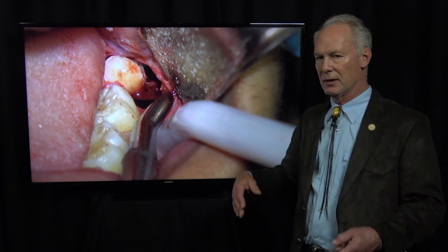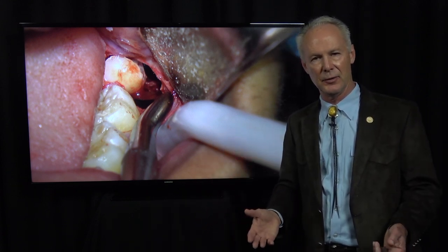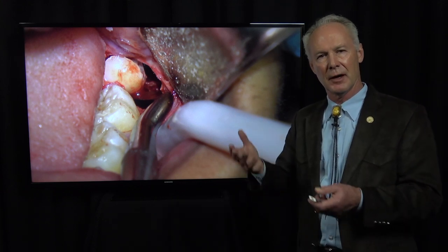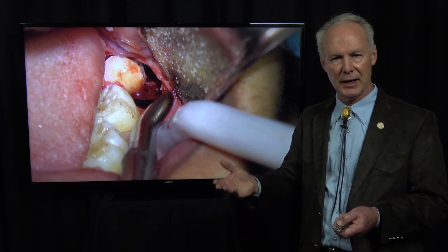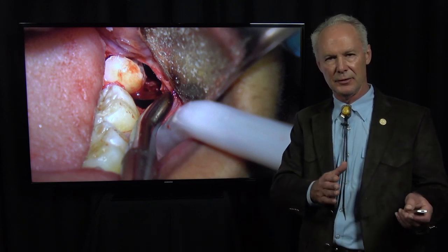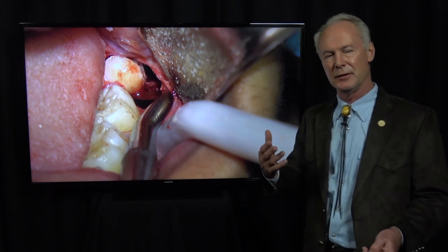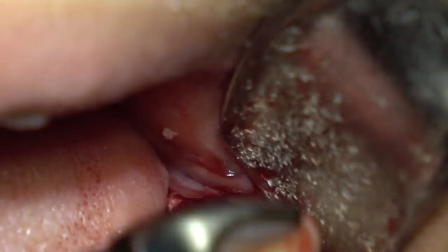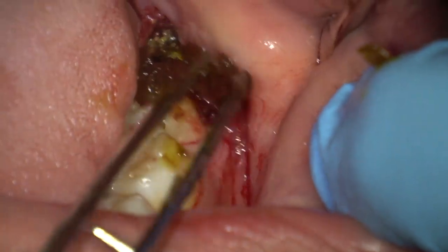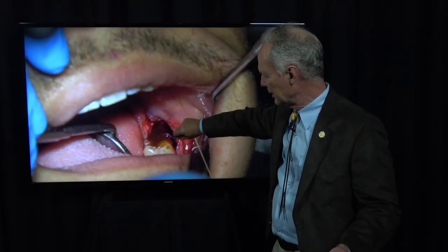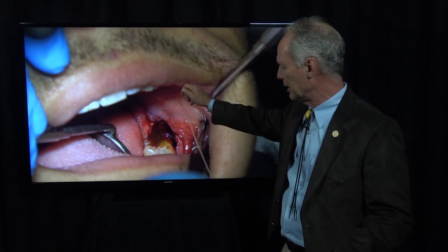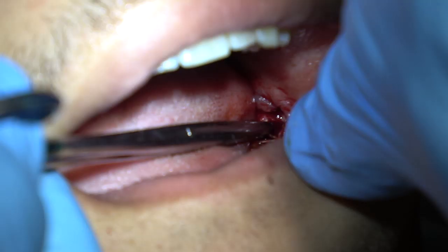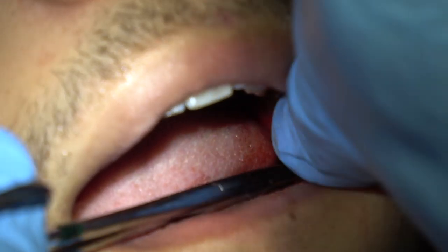You don't want to learn everything you know about extracting impacted wisdom teeth from my videos — you want hands-on training with someone who does a lot of surgery standing right with you to guide you through many surgeries before you take this on yourself. Here's the distal part — be sure to protect the airway with a 2x2 or mirror. Then the mesial part — take out the distal part and then elevate the mesial part. Irrigate the socket, remove the follicular membrane, and suture with two 3-0 gut sutures.